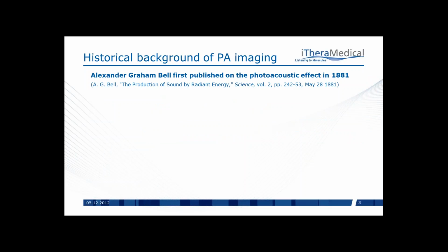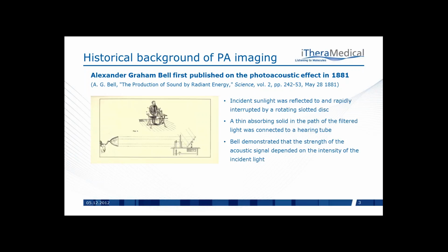Some individuals may not be familiar with photoacoustic imaging. The term photoacoustic, for example, is synonymous with optoacoustic imaging. These terms are used interchangeably. But the phenomenon was first described in a paper in Science that was published by Alexander Graham Bell in 1881.